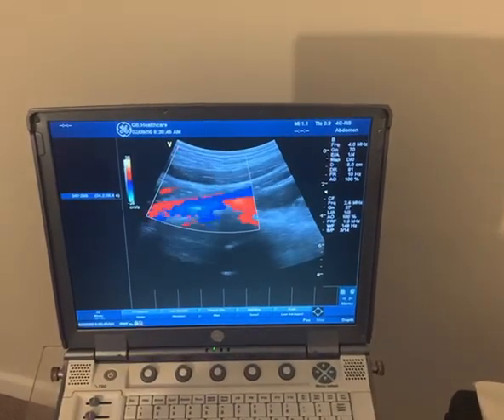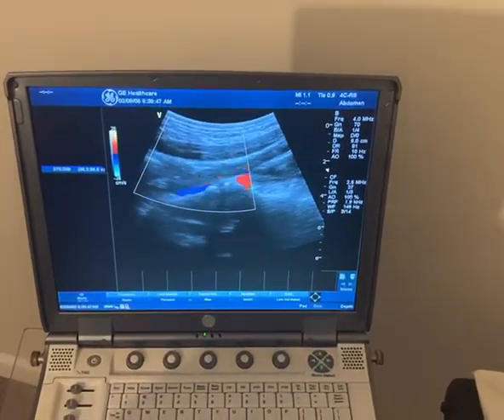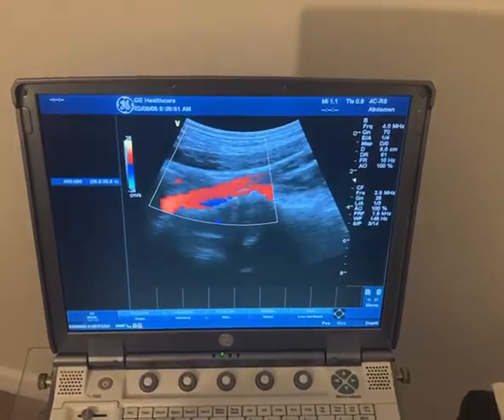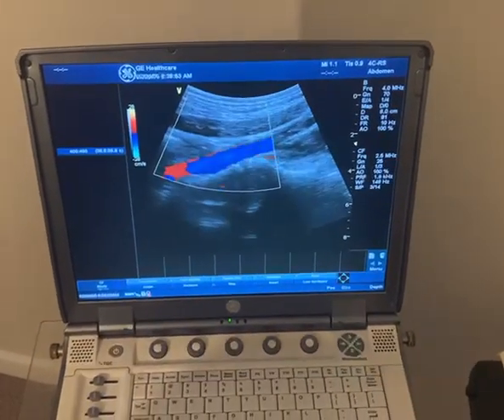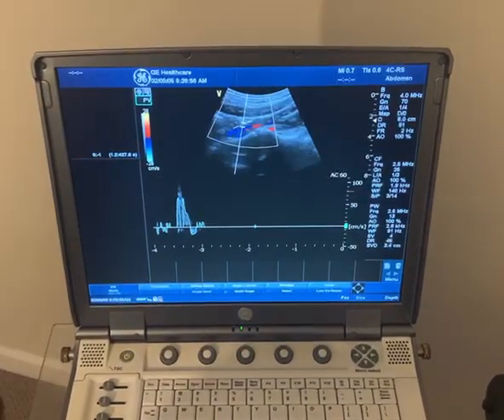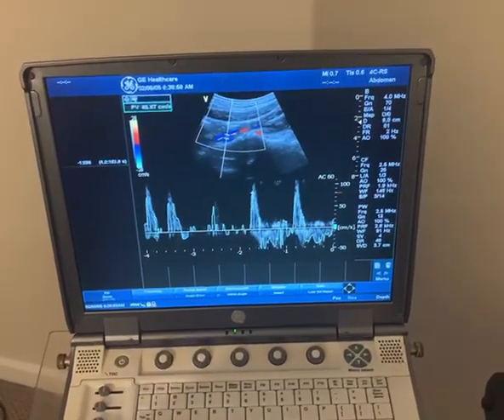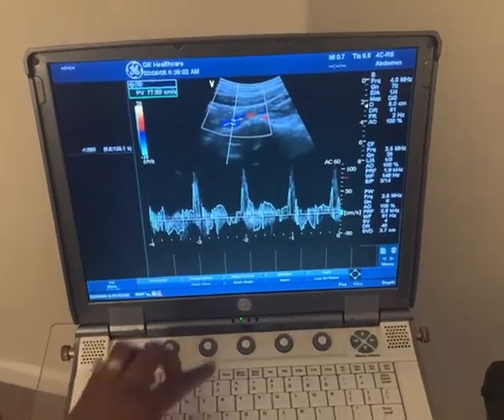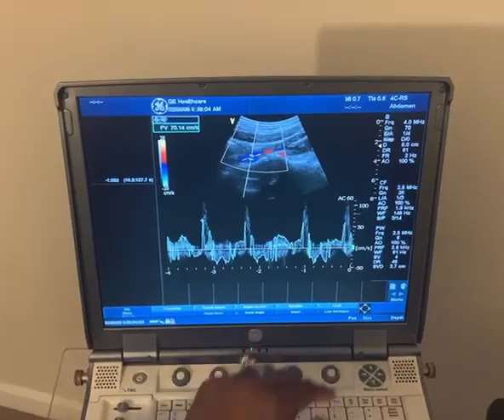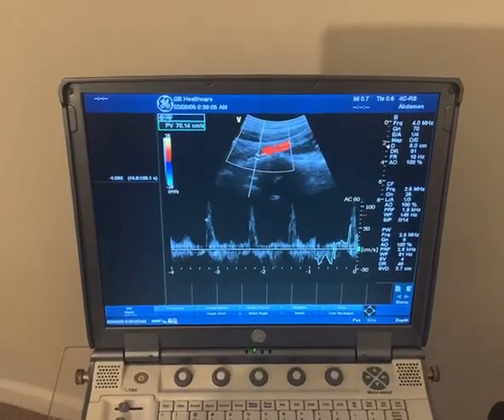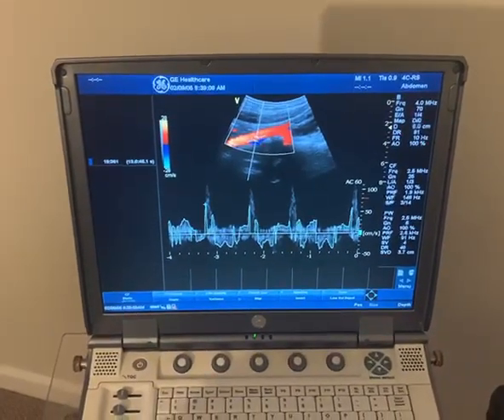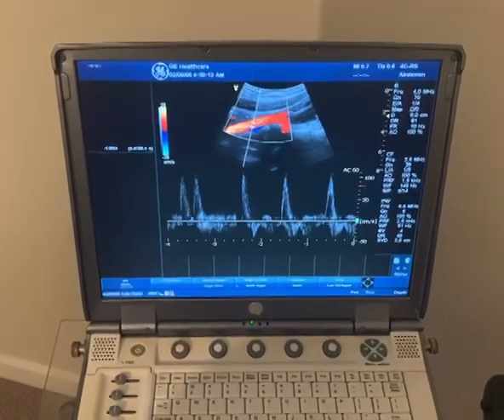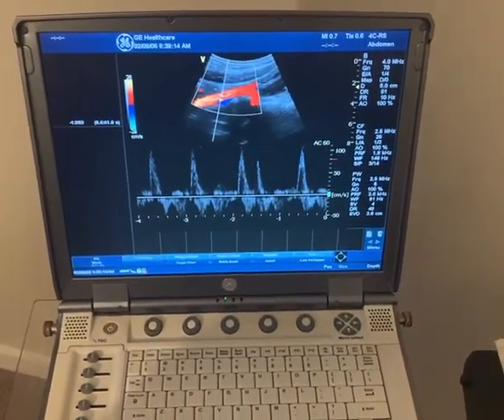I'm going to start by Dopplering the common iliac artery at the proximal segment. Turning the color down a little bit, we'll start with a pulsed wave Doppler of the proximal common iliac artery, and you can see it's nice and triphasic.